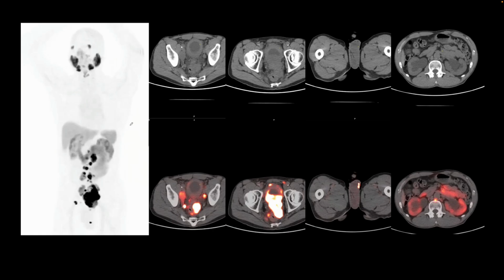So let's go to the cross-sectional images. Here we find that right here we have this very large tumor arising from the prostate and invading the surrounding tissues, especially the rectum. We have PSMA avid metastatic disease in both sides of the pelvis. And look at the urinary bladder. There is no excreted PSMA inside the urinary bladder, and that is because both kidneys are showing severe hydronephrosis and hydroureter because of this locally advanced tumor occluding the ureters at the vesico-ureteral junctions, or the UVJs.